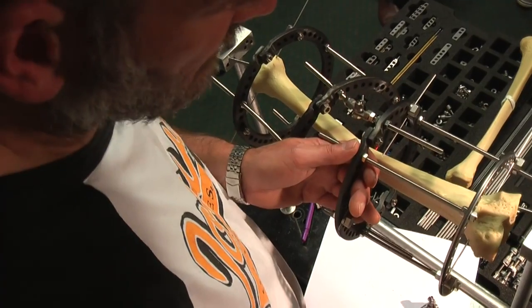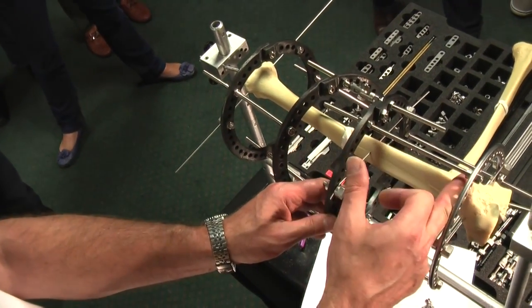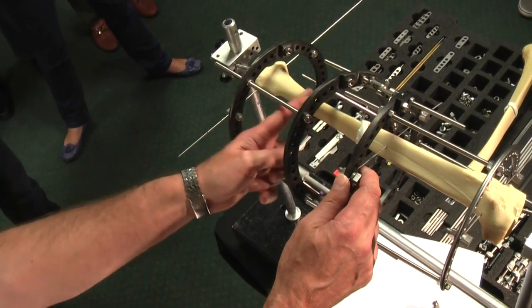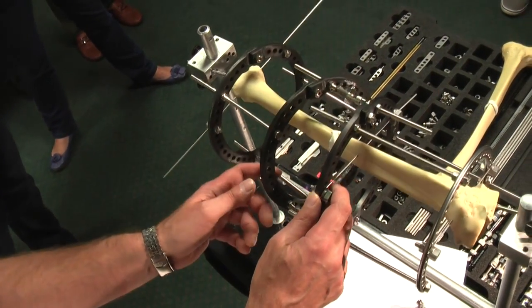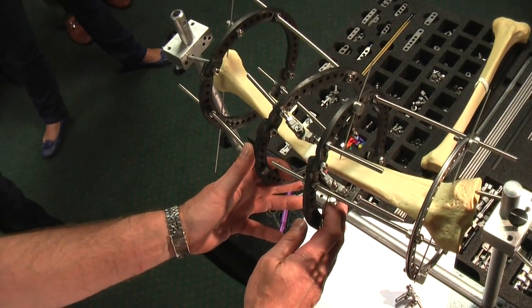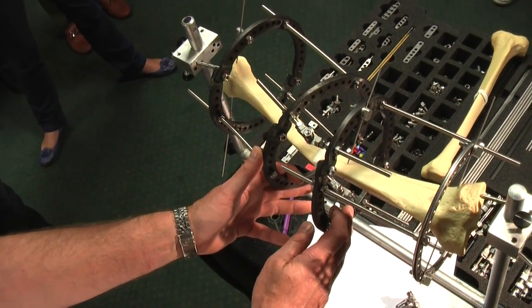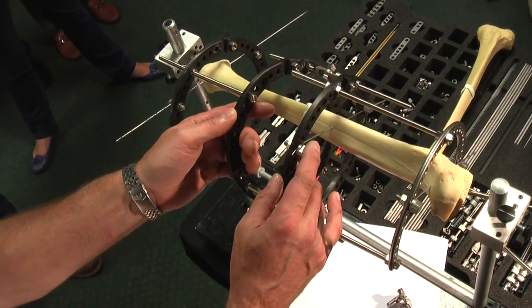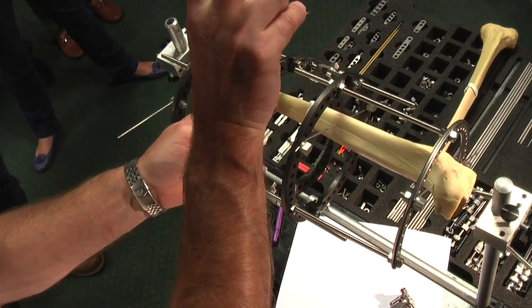Okay. Because if we've got this about right, that rod should be parallel to the front of the tibia. Yeah? If I just roll it round so you can see it, that rod should be about parallel to the front of the tibia. Yeah? If I drop it all the way to there, that frame should be about straight as you look at it. Okay? Which means that if I turn it to there, the hands on the clock should say 5 to 12. That should be 30 degrees as you look at it in there.